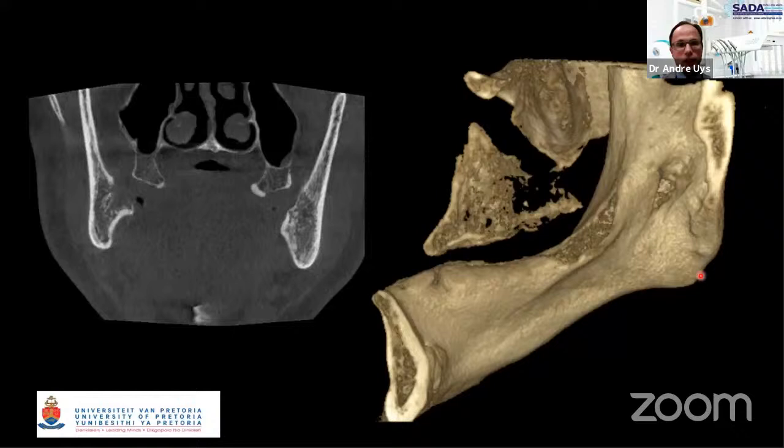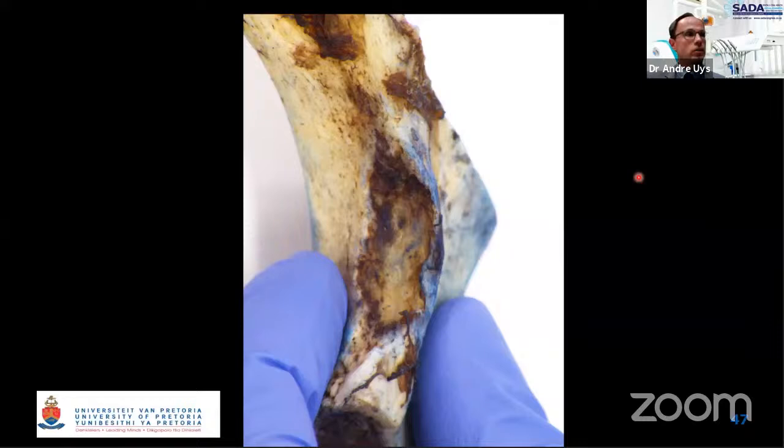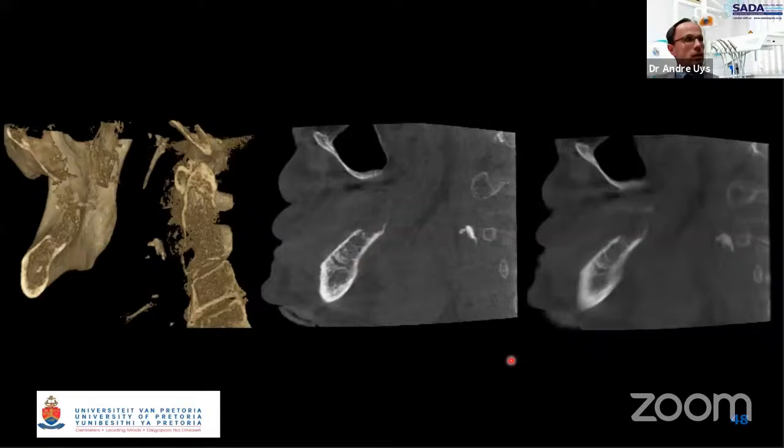That is just a clinical photo of the resection, and there you can see the infiltration into the underlying bone. The CT also showed up the calcifications. And here you can see the calcifications in that prevertebral area there. And that is just to show it on that side as well. So the calcifications were in the area of the carotid artery. And for this type of patient, you've got to refer them for further medical investigation, as well as additional imaging like an ultrasound for confirmation.